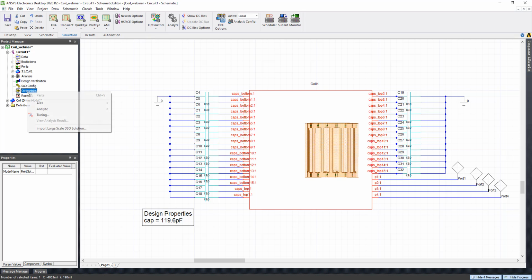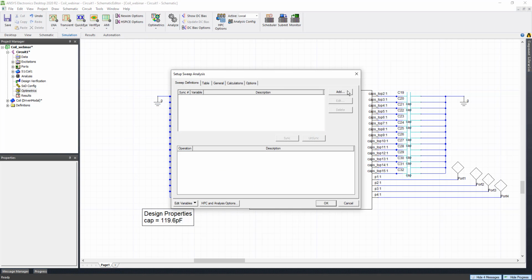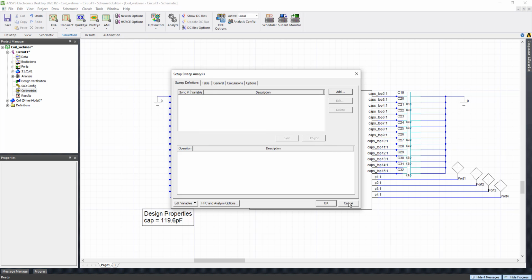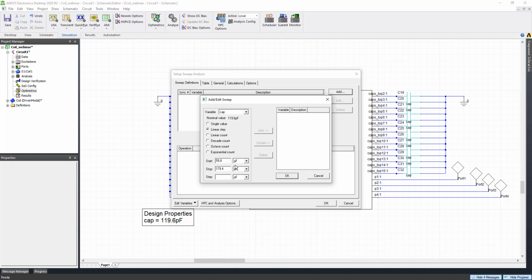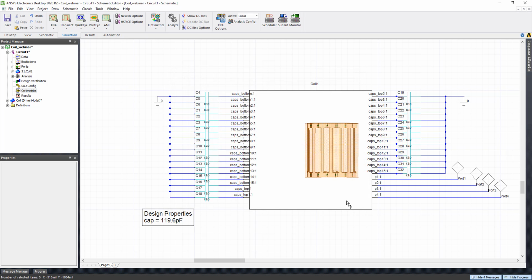Yeah, so next we can add a parametric. Or not next, but if you want to do a parametric analysis for your capacitors, you can always add parametric and then add the capacitor. You can tune it for different values. Let's say I have this, and then what's my step? My step is, let's say, 1. I add it. Okay, now I have this, right? But I don't want to do it right now. So if you want to try out something like this, feel free to let me know.